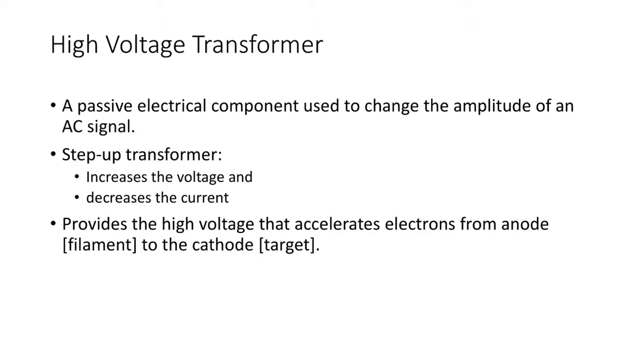Again, this transformer is responsible for providing the high voltage, which accelerates the electrons from our filament to our target. This is very, very important.